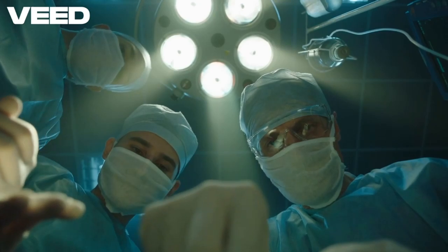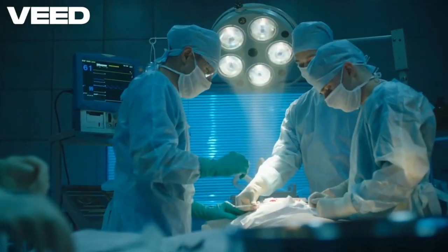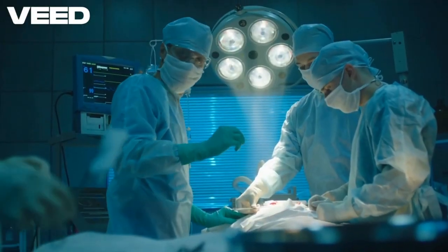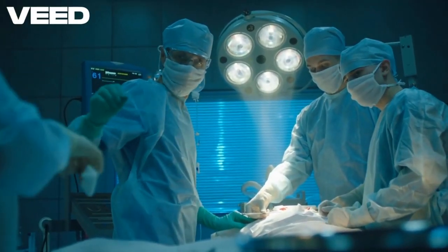There are three key tympanoplasty techniques. The choice depends on the location and size of the perforation and the surgeon's experience. In the underlay technique, the graft is placed underneath the remaining tympanic membrane. It's commonly used for small to medium perforations.